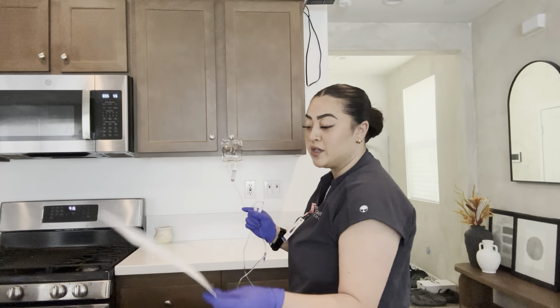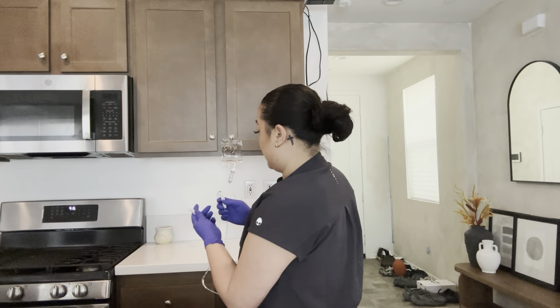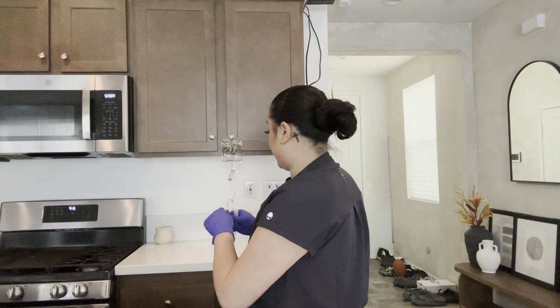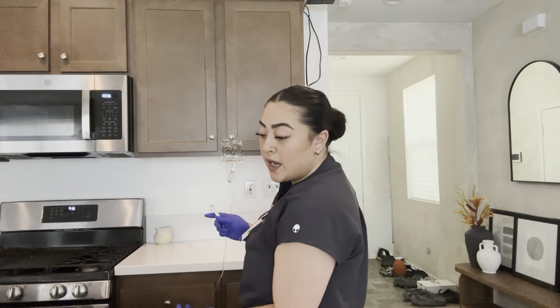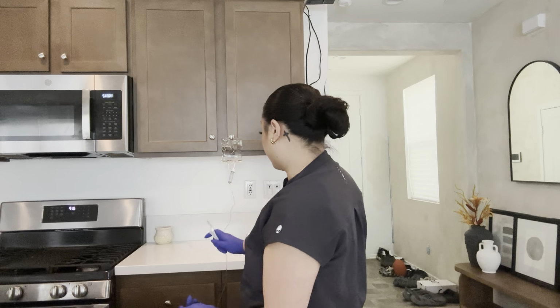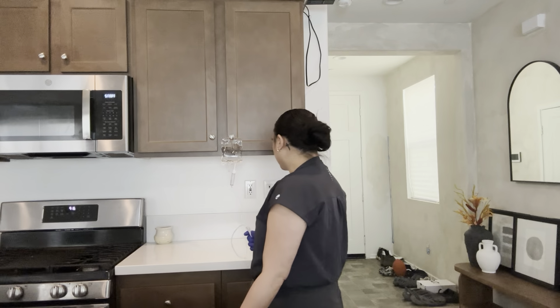So now what I'm gonna do is I am going to adjust the clamp, and I'm gonna do this for 1 minute, and we're gonna do the 38 drops for 1 minute. So I'm gonna go ahead and do that and just watch it.